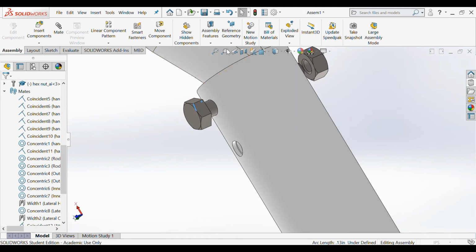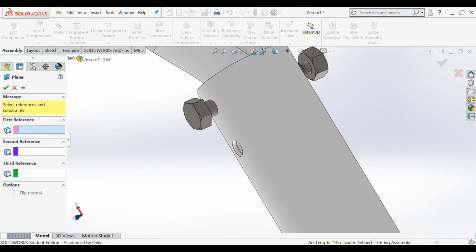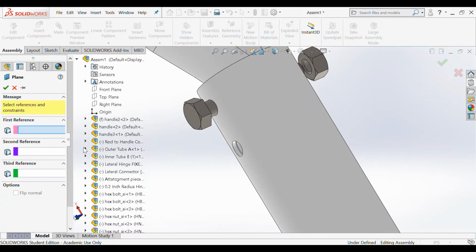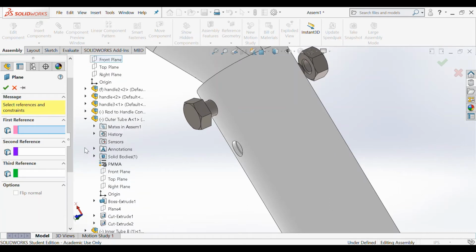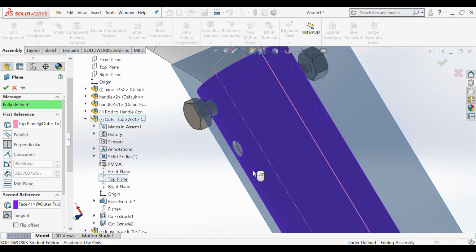and create a reference plane, and I'm going to choose a first reference using one of the planes from the outer rod. So I'm going to go on ahead and choose the top plane. As you can see, it goes directly down the center of the rod as the first reference.